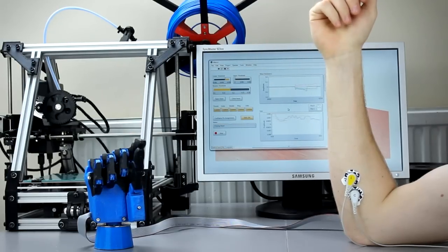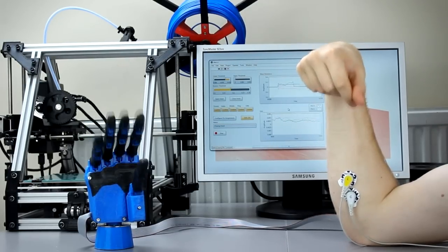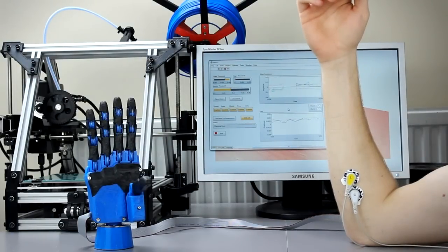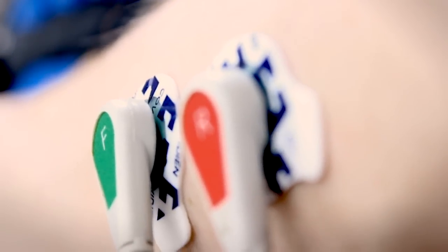The hand works by picking up signals from the user's muscles. When you flex a muscle, it gives off a signal which can be detected on the surface of the skin. Electrodes pick up these signals and send them to electronics in the hand. It then reads this information and works out which movement the user is trying to do and executes it.